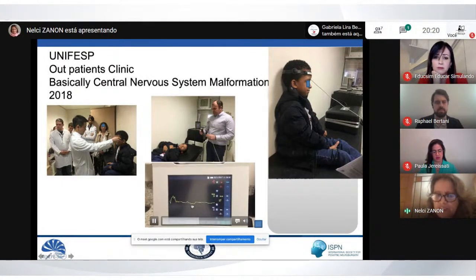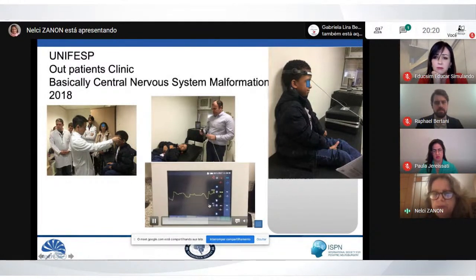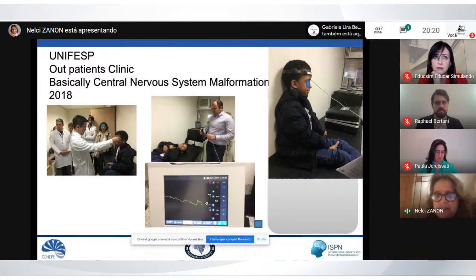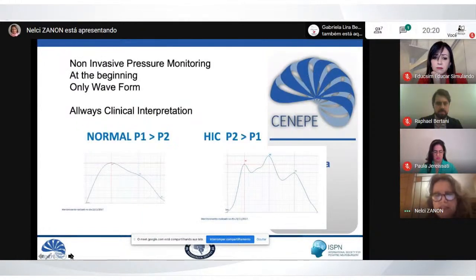It's not as easy as what we saw before. It's not a problem at the moment because these waves go to the cloud, and the analytic system does some clearance on these waves and sends us a very, very clear image.